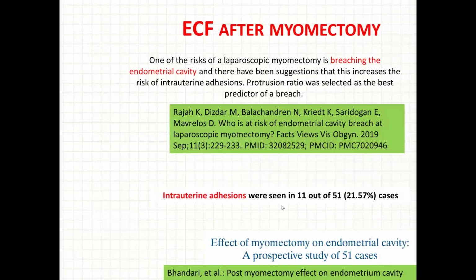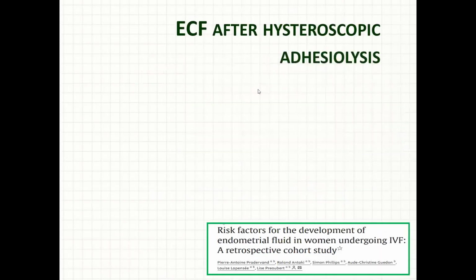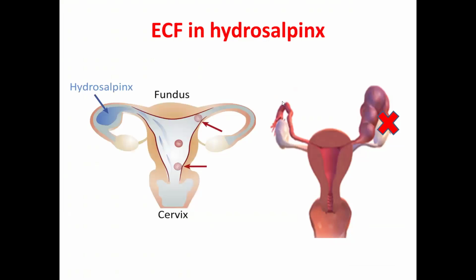Also, you can see excessive endometrial cavity fluid after myomectomy due to possibility of scarring and retention of fluid, also after adhesions or after adhesiolysis if it is incomplete.